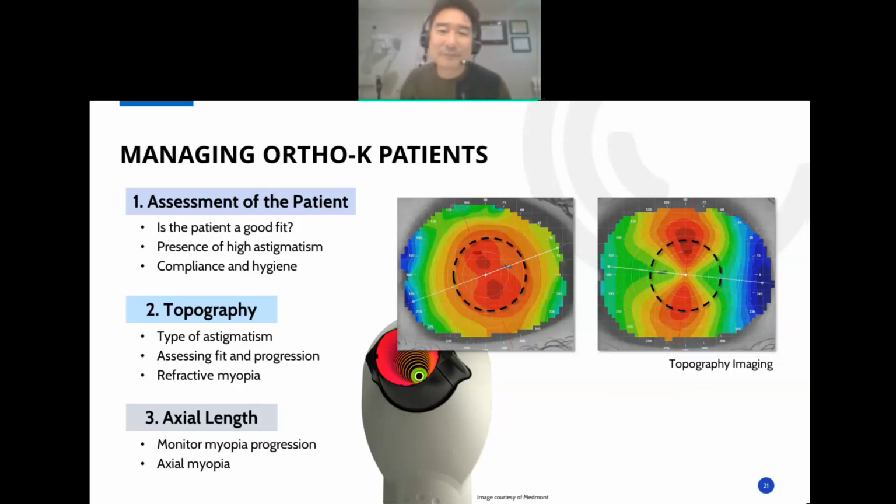The one that we always want is a bullseye design, but sometimes you get something called smiley face, frowny face, or sometimes central islands. You'll learn all those terms in school. That's when they'll tell you how to troubleshoot, and each company will have their own different way of changing it. But at the end of the day, usually they'll change the curvatures of those curves.